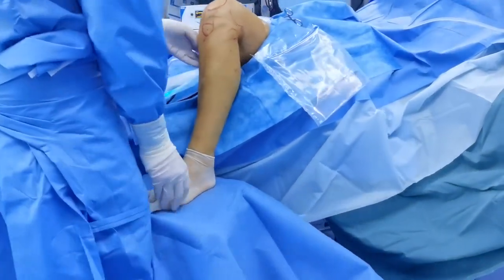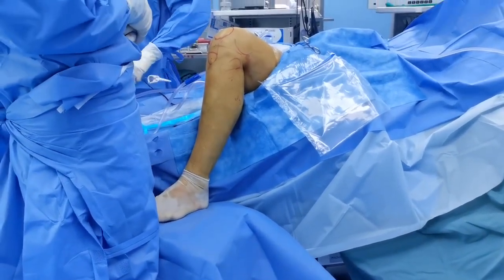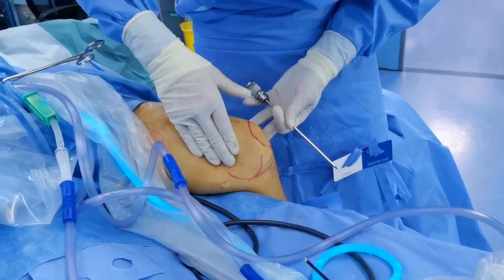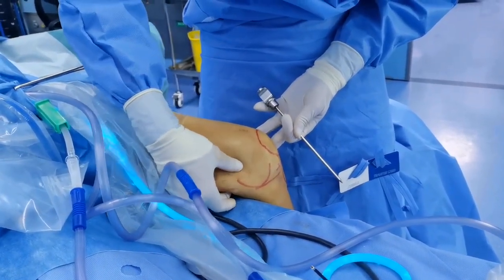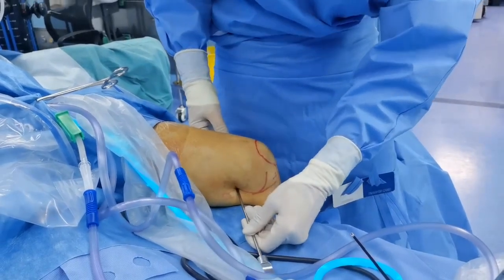Creating the posterior portal in arthroscopy is also a challenge because of the shape changes of the thick muscle. The soft point of the posteromedial portal between the femur and the tibia cannot be easily palpated, especially when the leg is angled over the lateral aspect of the surgical bed, without extrusion and deformation of the thigh muscle.